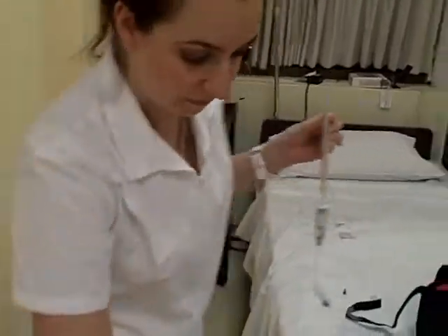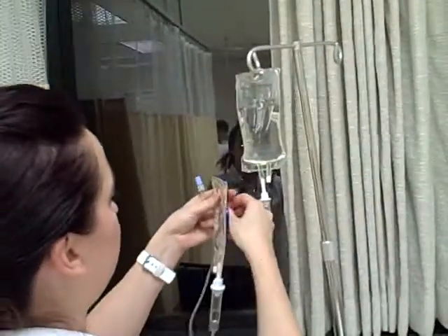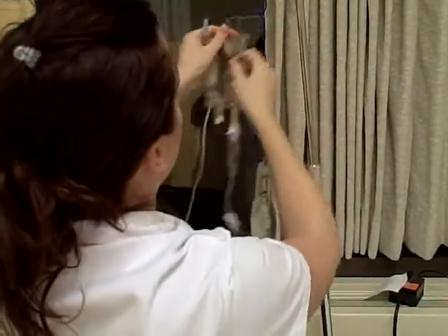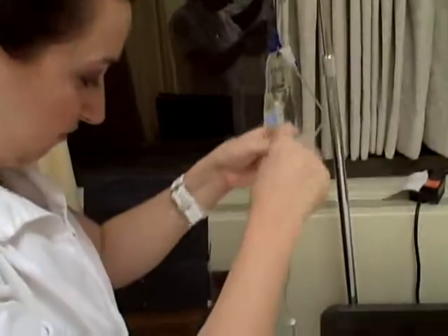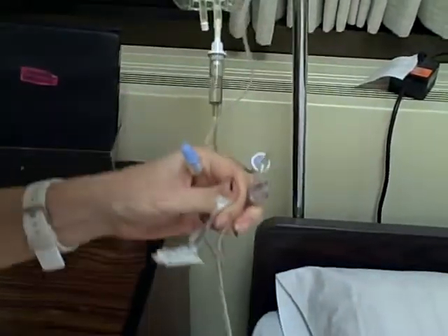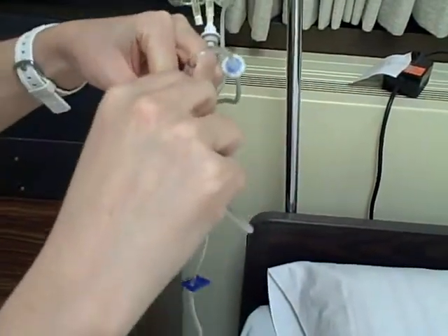Once I get into the room, this IV will be hooked up to a patient and it will already be running. I'm going to make sure that the bag is going to be lower than the medication. I'm just going to hook this up. Then I'm going to take my alcohol swab, make sure that this tip is nice and sterile, and I'm going to hook this up to here.